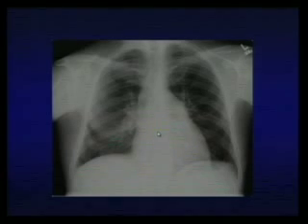So in the proper clinical setting, you can order or suggest the possibility of PE and suggest a CT angio that is the gold standard to diagnose this disease. We cannot use the chest X-ray to diagnose PE, but we can suggest that possibility.